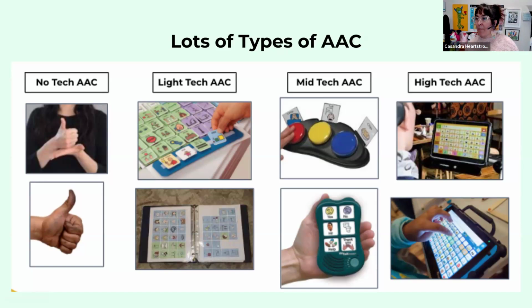But I feel like it would be really sad for me if I only had this paper-based method to communicate, or if I only had this mid-tech button output message method of communication.